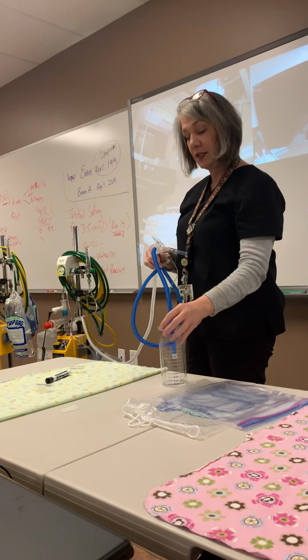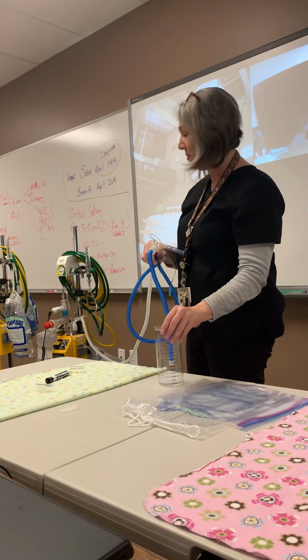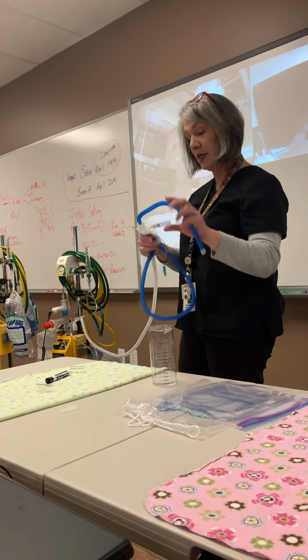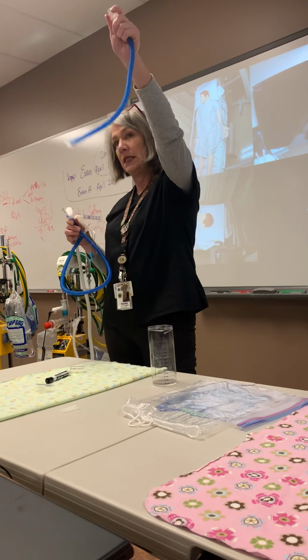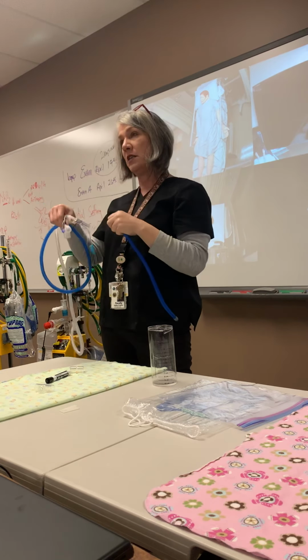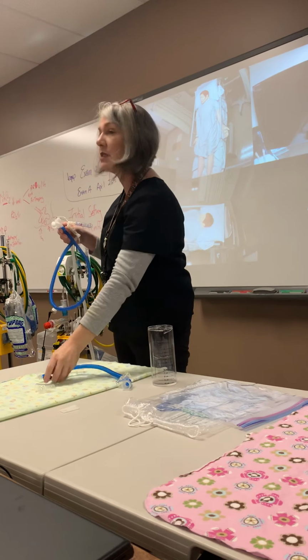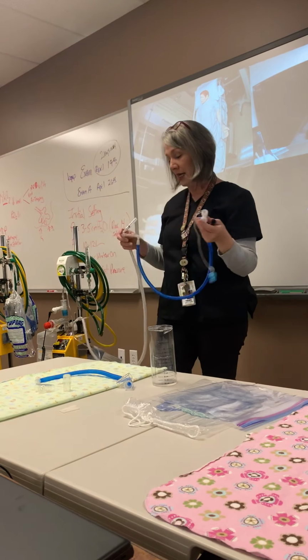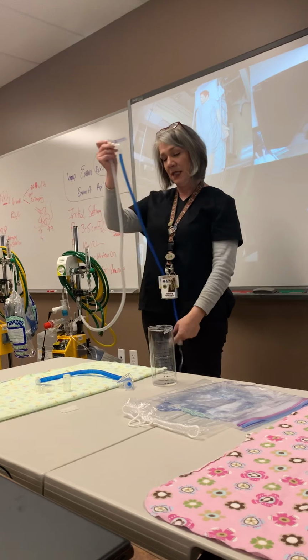All right? For the Davis system, I'll go get my Davis adapter or my Davis water column because it's different. You don't need these 2 pieces. You don't need the 19 and the extra piece. This just goes right on the top of that adapter. I'll go get it so you can see it. That's the only difference.